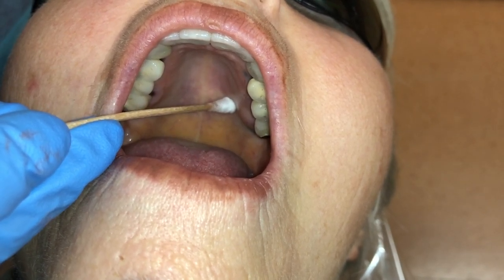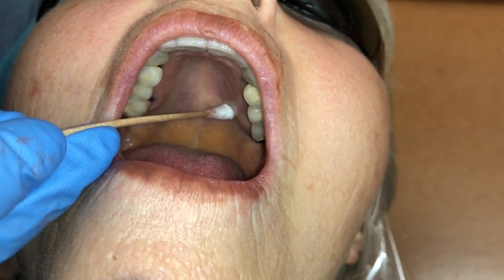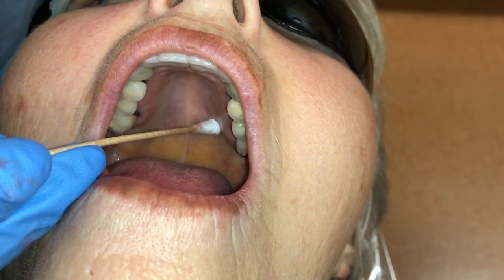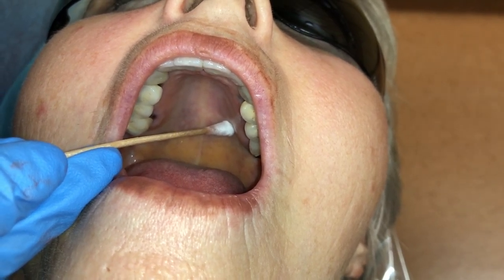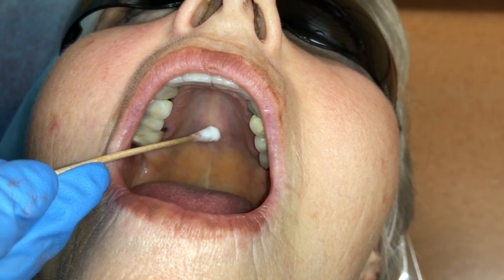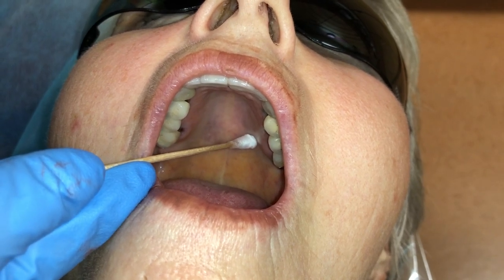You'll notice in the video the clinician is using the q-tip to slide posteriorly to identify the depression made by the greater palatine foramen. This would be the approximate angle and location for pressure anesthesia. When utilizing pressure anesthesia, the clinician must slide the q-tip but maintain pressure near the foramen.